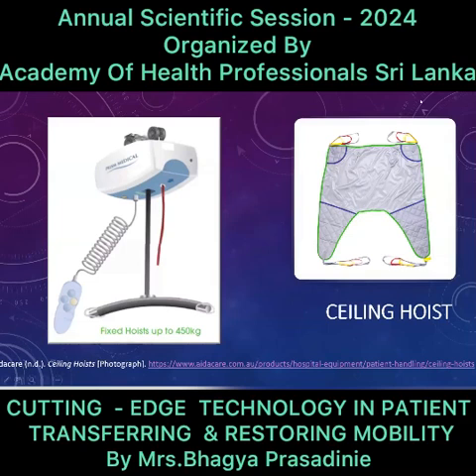So the right side image is a sling. That is what we use for the patient to connect to the machine. So basically, with this machine, we can lift an immobile patient to a chair or a wheelchair or whatever the sitting position is. Because usually in Sri Lankan context, if the patient is immobile, it's quite hard for us to transfer a patient to a sitting position. But here we have these sort of equipments. We'll discuss some more equipments later on.